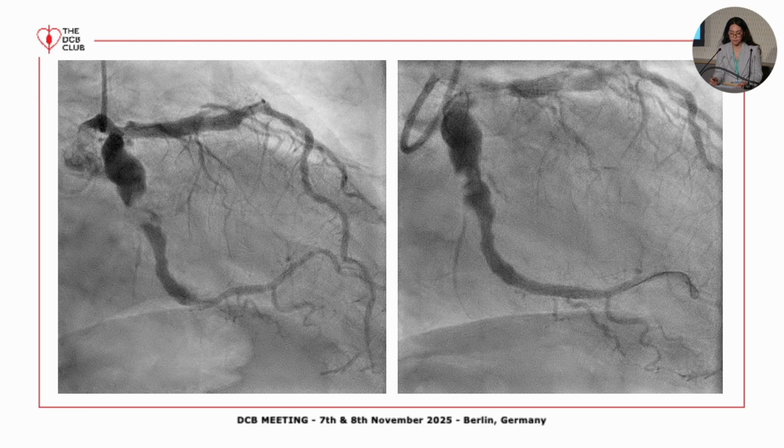Once we had a reasonable TIMI flow, we decided to take a closer look with OCT, mainly to understand what's clearly happening there.